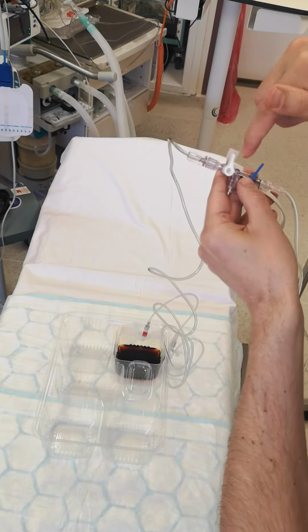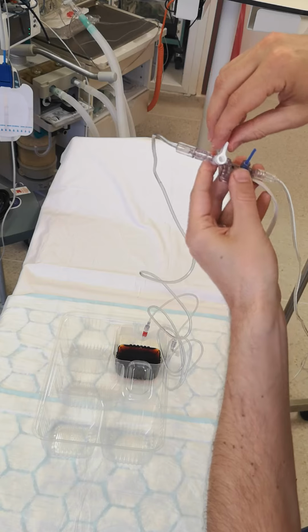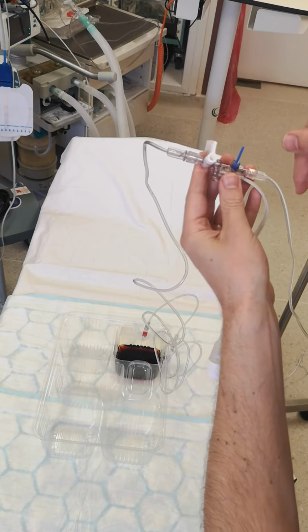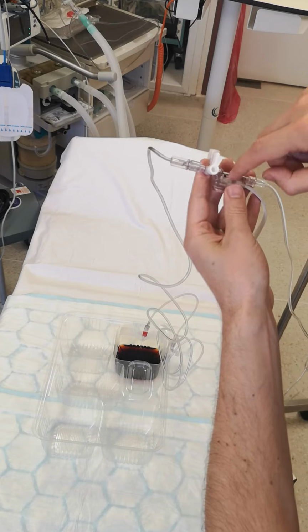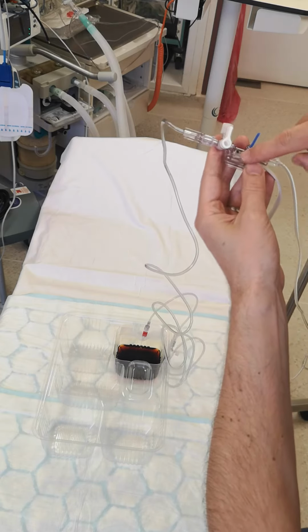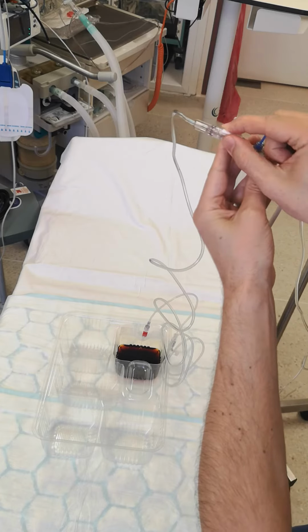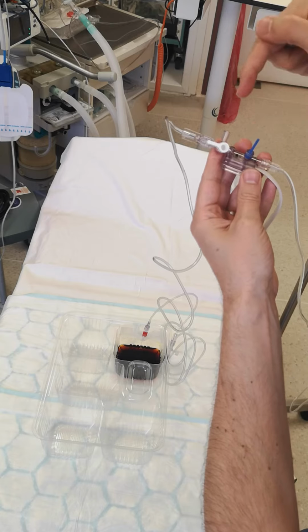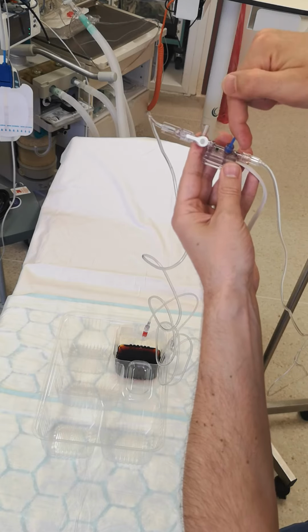This valve, the long arm is off. So at the moment, you can see it goes through here all the way to the bag and to the transducer. To zero it, what we want is the transducer measuring air. So we have to turn it off to the patient, take that off. So now the open part is basically air into the transducer.